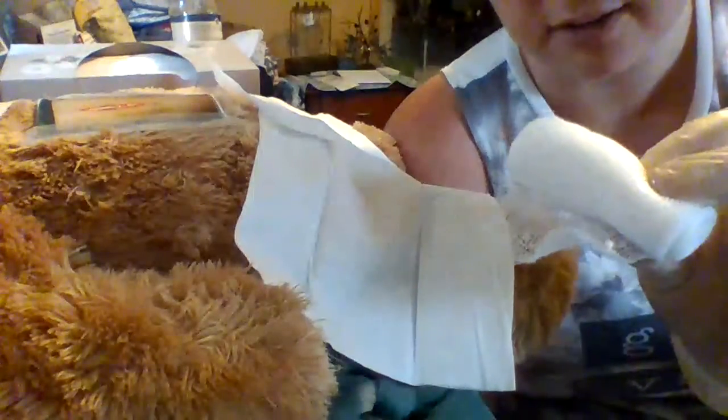But if you could pack your wound, you would just soak this gauze into the saline. And then you would just kind of pack it in with these Q-tips. So how that works is, as you're putting part of the sheet into the wound, you just kind of push it down into the wound. You don't want to pack the wound too tightly though, so just keep that in mind. So if I was doing a wet to dry, I would do that.